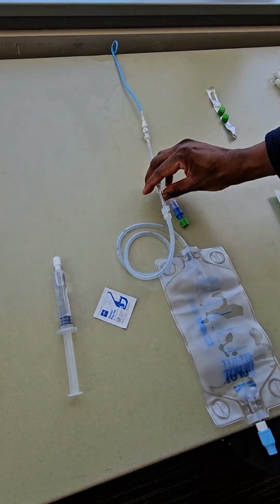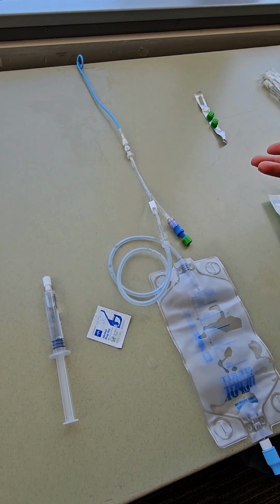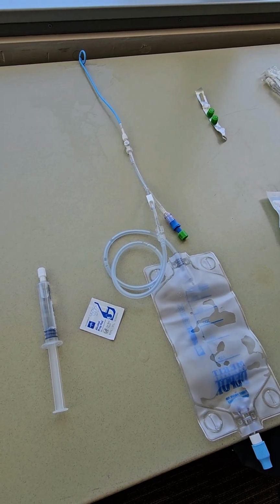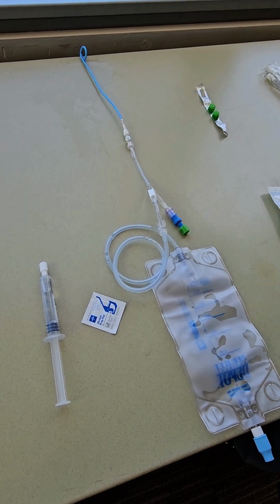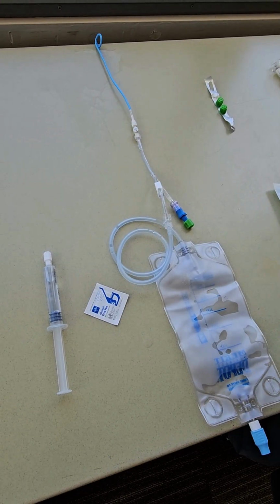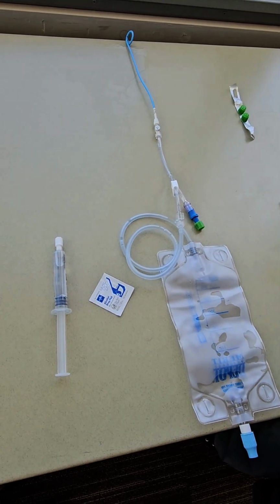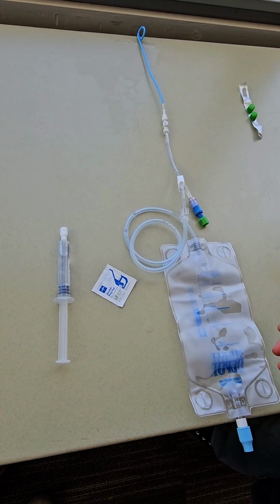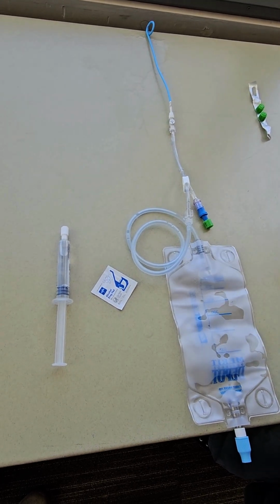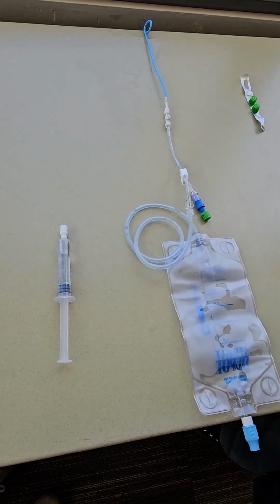So in terms of flushing the drain, we typically ask patients to flush once or twice a day. We'll typically ask them to flush 5 cc's of sterile saline into the drain and 5 cc's into the bag so that we can keep the whole system open. There are, of course, variations in practice when it comes to this with different IR departments at different institutions. So you can check with your particular institution to figure out what configuration they come with and what they're telling patients to do as far as flushing goes.